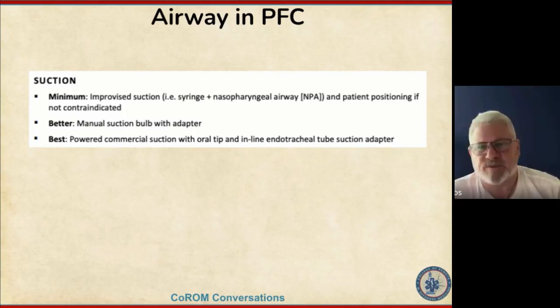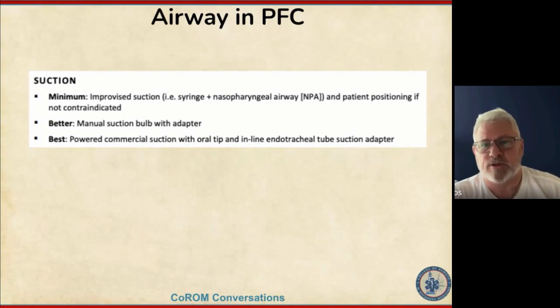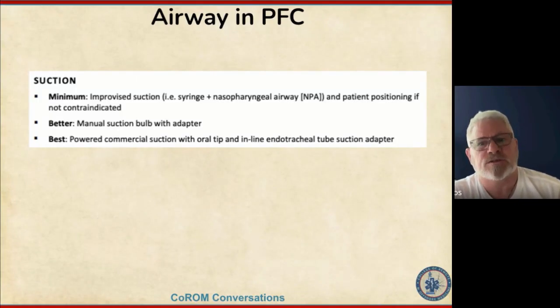I would say practice with something like baby food initially, and then throw some chunks in there, throw some cut carrots or peas, or, without making this a Betty Crocker cooking class, just start off progressing. Start off with clear liquid. Can you get clear liquid through a syringe and an IV tubing? If you can't get clear liquid, then that's a good indicator that it's not going to work when you actually have real secretions with chunks.